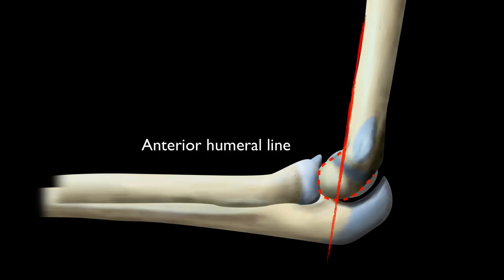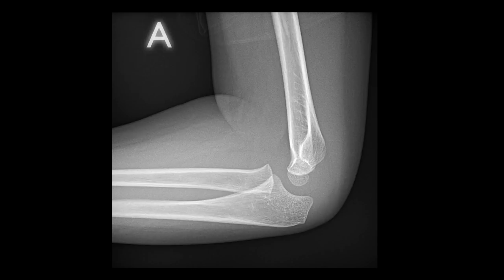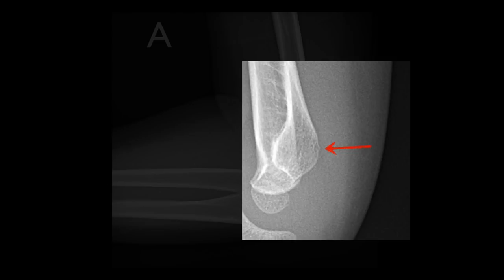Let's look back at our cases. In case A, if we draw a line down the anterior surface of the humerus and then draw in the expected location of the capitellum, we can see that a force applied down the radius has displaced the capitellum posteriorly. In addition there is an anterior fat pad indicative of an elbow effusion. There is also irregularity of the dorsal cortex that represents the fracture.